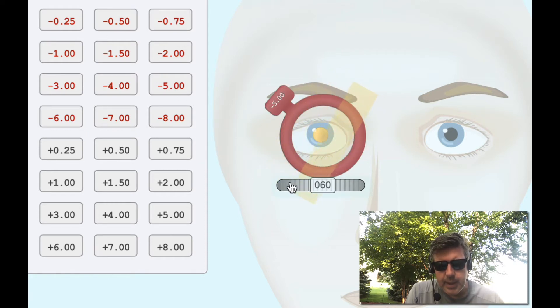I just want to see how the reflex 90 degrees away compares. Here I see more against motion and a thinner reflex. Here I see a thicker reflex, so this is going to require less minus to neutralize, and this is going to require more minus to neutralize. I could arbitrarily pick one, but since I said I was going to do plus cylinder, I think I should neutralize the more minus meridian first.